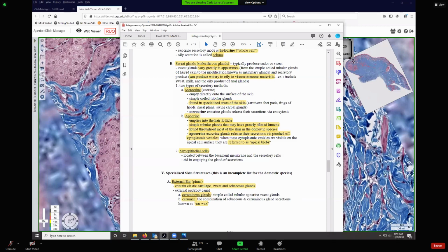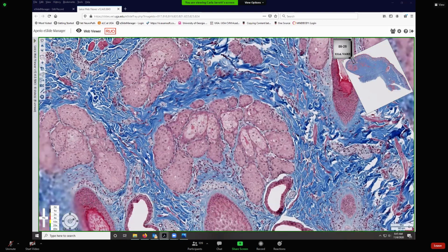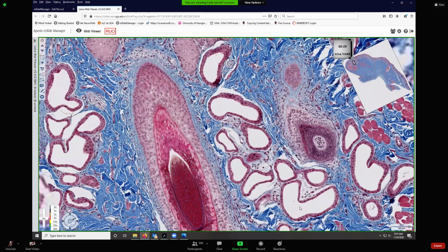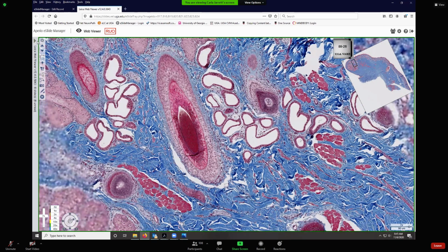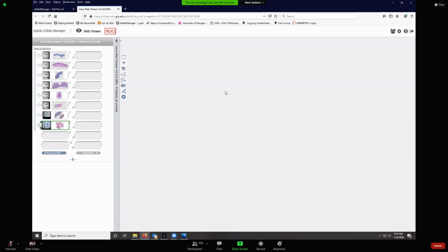Okay. All right. So why are we talking about that in detail? Well, because sometimes you'll see those apocrine blebs. So here are sweat glands, simple coiled tubular glands. They can have a very dilated lumen. They tend to have just a simple cuboidal epithelium lining them, but that can become columnar. So where can we see that? We can see that in this slide.